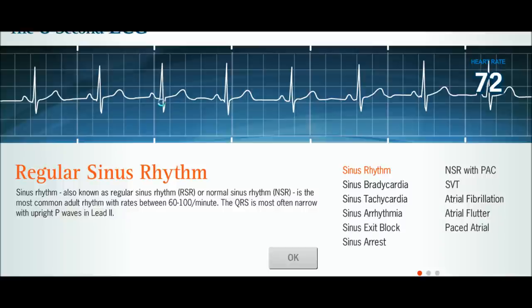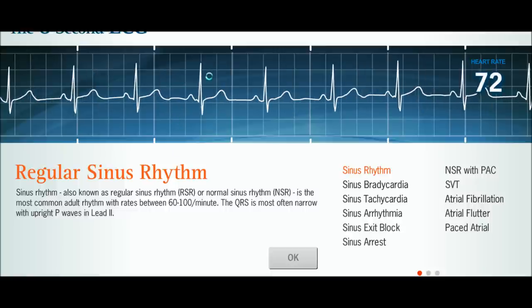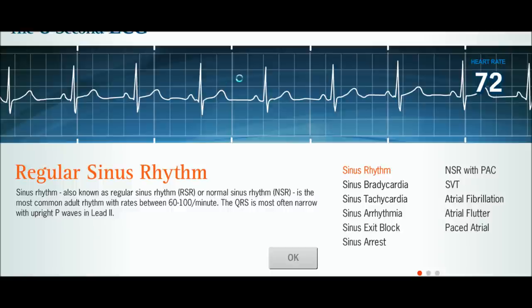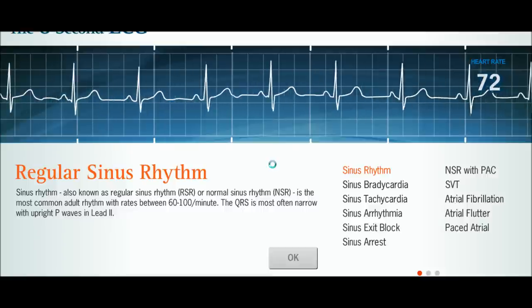The way that heart rate calculation works is you count down from 300 — each large square equals 300, then 150, 100, 75, 60. So if the QRS complexes were one square apart the rate would be 300; two squares gives 150; and so on. It's just a quick way you can look at your EKG rhythm strip and figure out the heart rate.